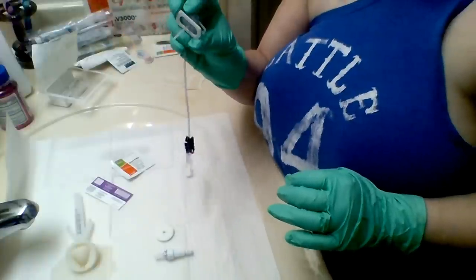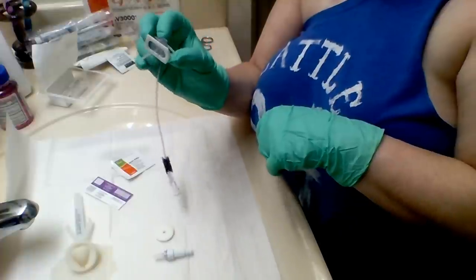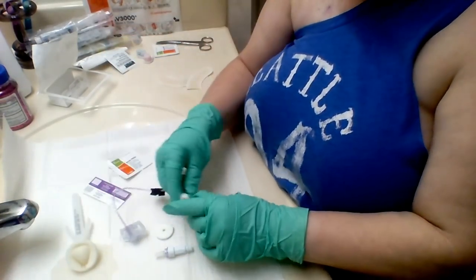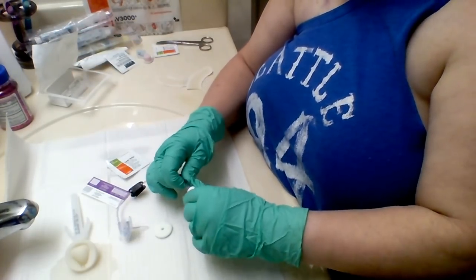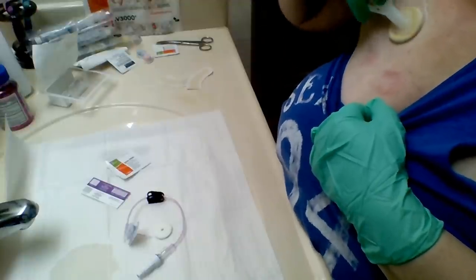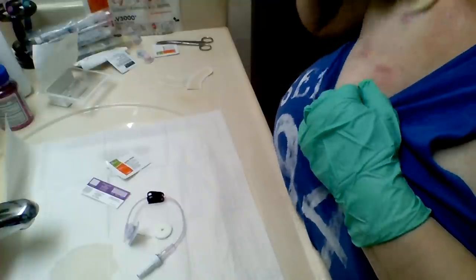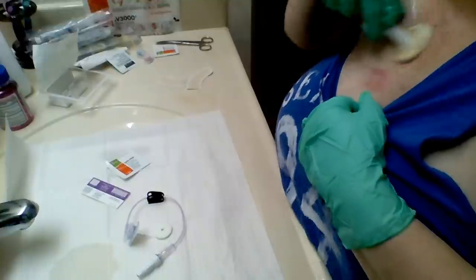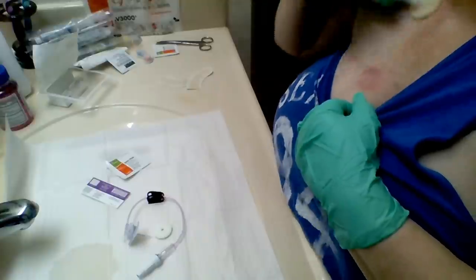As you can see, the Huber needle has a needle that has something on it — it reminds me of a little hummingbird. So with this, we're going to take this off, unclamp this, and put this together. And we are going to finally clean this site. My skin is already irritated from the last dressing change — my skin is so sensitive to everything. That is adhesive stuff coming off from the chlorhexidine — it's removing it. I'm so irritated.